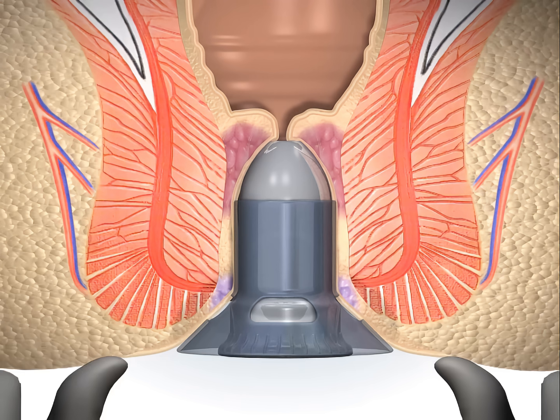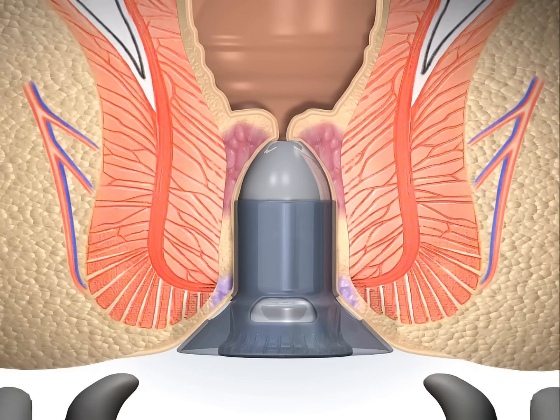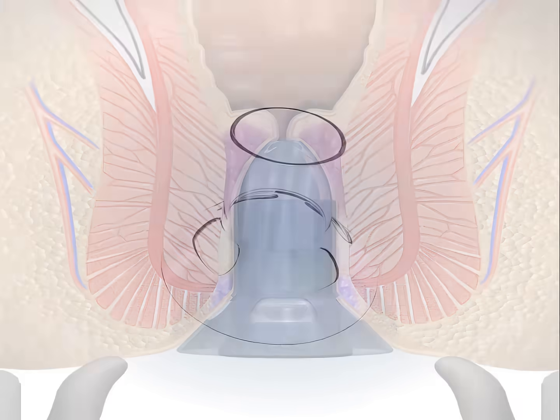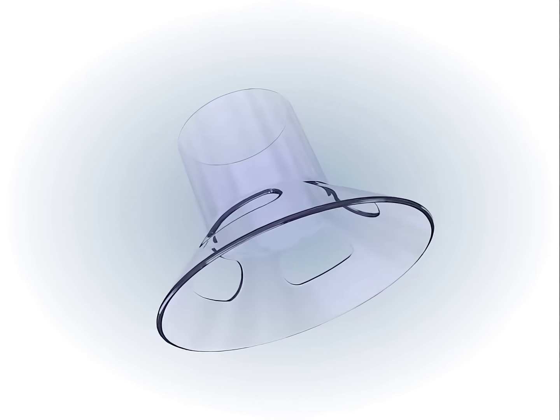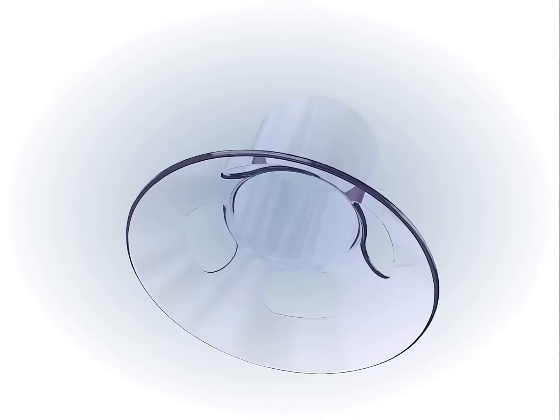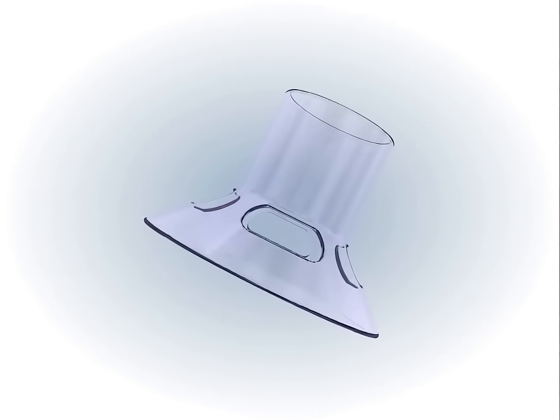This will help ensure that the dilator has been inserted far enough to protect the dentate line. The phalange of the circular anal dilator is provided with 4 slots in order to secure it to the perianal skin so that it is held firmly in place.